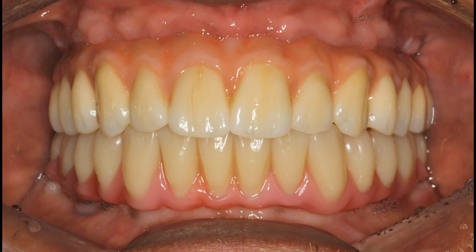Here we have on the same day the upper definitive zirconium prosthesis with the lower prototype wax up. Why do we do this? In my practice, the upper's made by one lab and the lower's made by another. We want to make sure the bite is right. So we try everything in one more time and make a new bite record so that when the lower comes back from the other lab, we're not making significant adjustments.